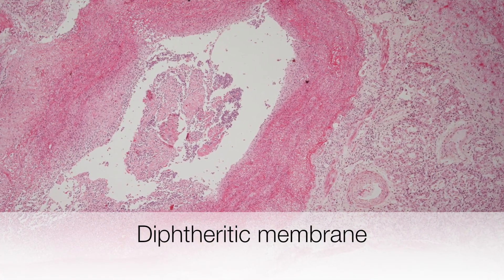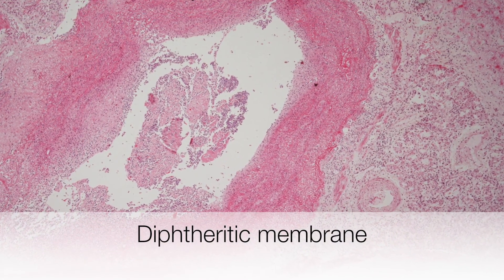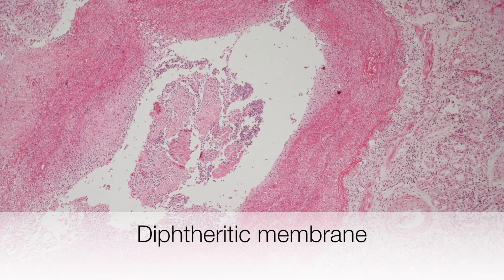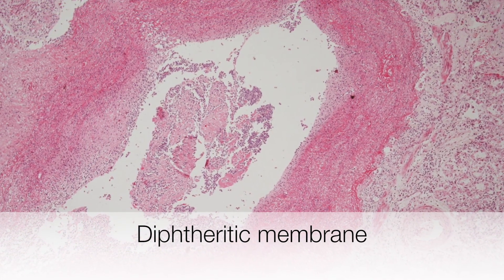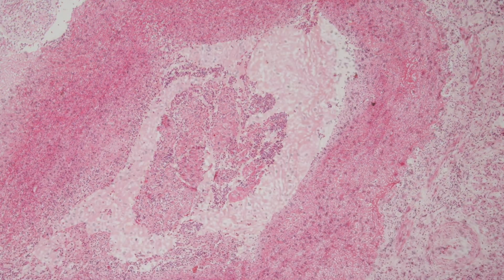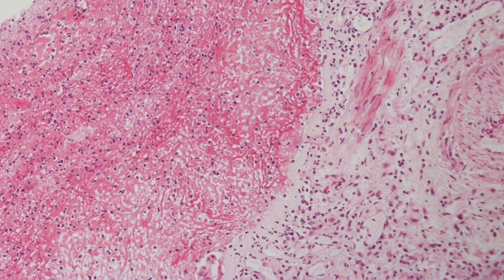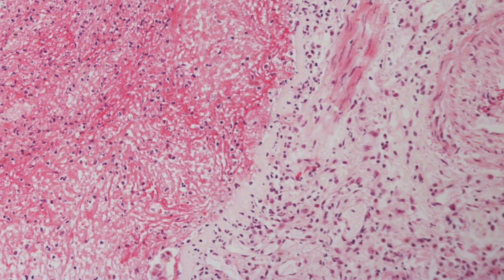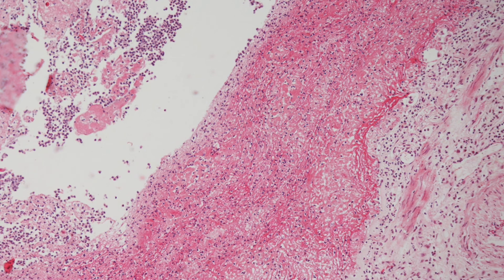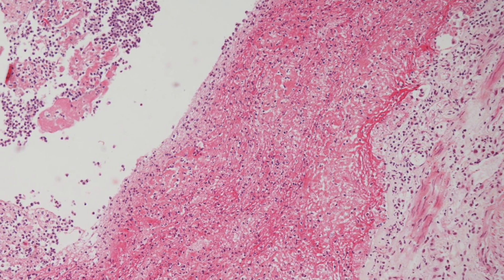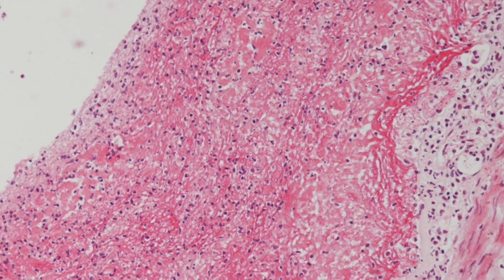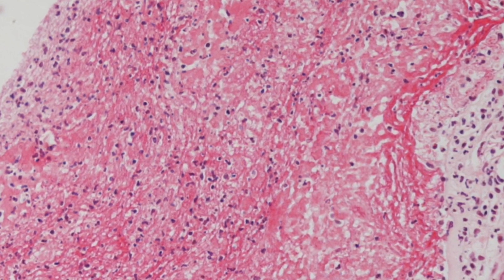This is a low-power view of a bronchus damaged by diphtheria toxin, which has produced a diphtheria membrane — the reddish ring visible towards the left of the picture. Beneath the membrane, the submucosa is edematous, acutely inflamed, and congested. On higher power, the membrane is composed of fibrin mixed with an acute inflammatory exudate, producing this pseudomembrane.